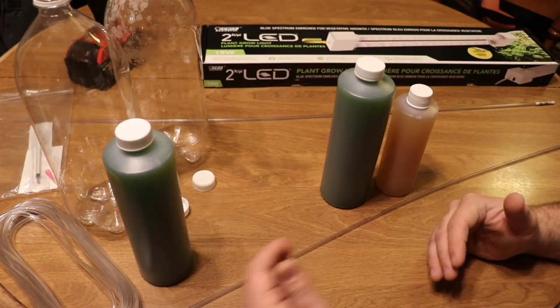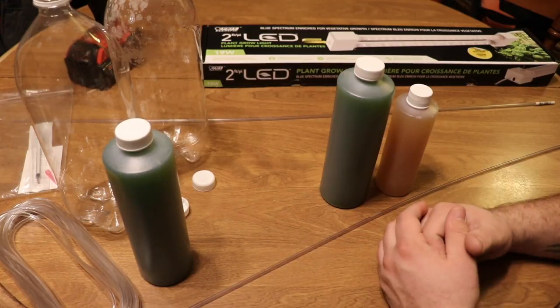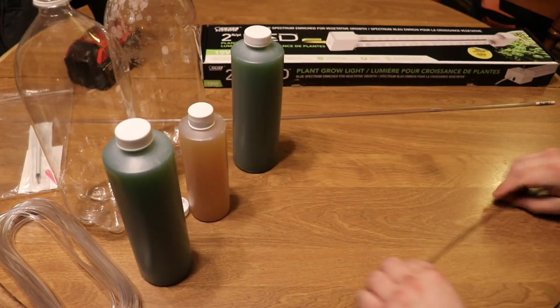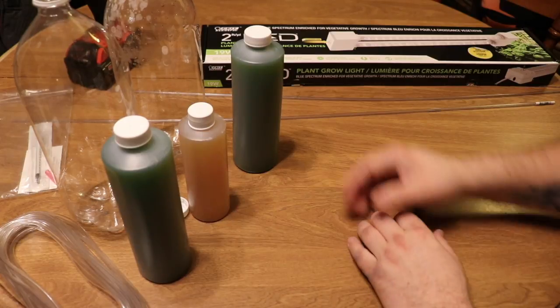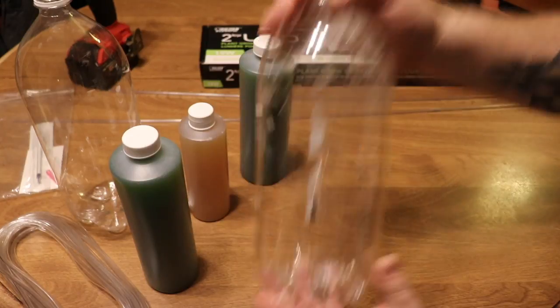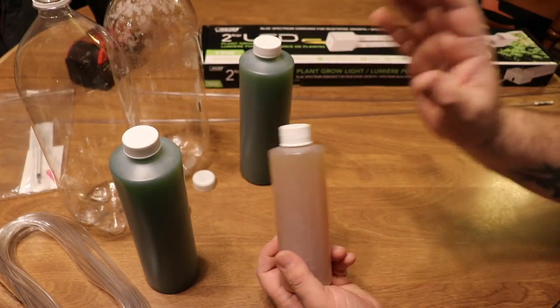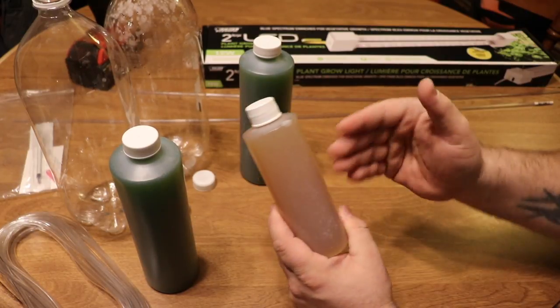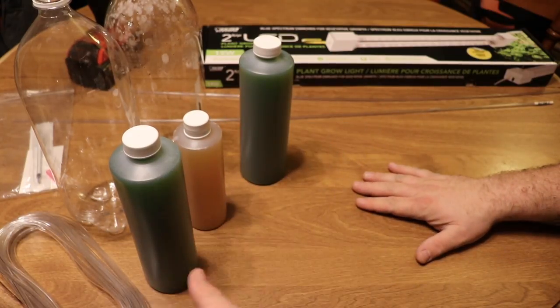We've got rigid airline tubing, airline tubing, an air pump, phytoplankton starter cultures, vessels to split the culture into, and F2. You don't have to get F2—I believe Fritz Aquatics makes a product now for culturing phytoplankton.